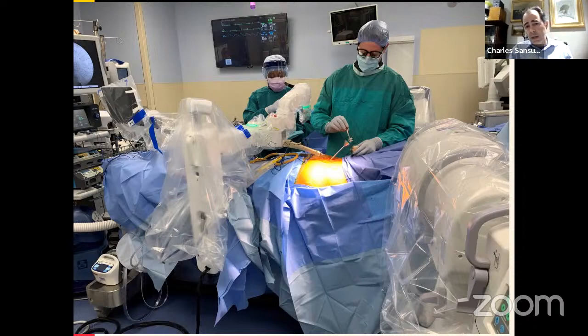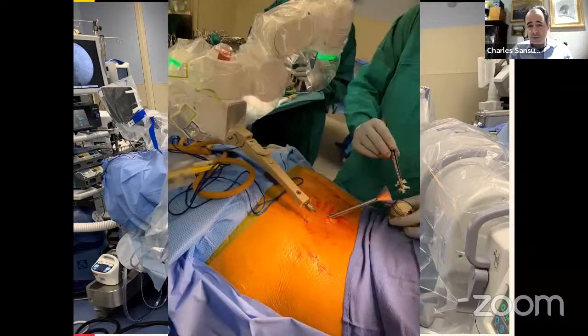The bone funnel is about nine millimeters in diameter. We drill a hole of equivalent diameter to the outside of the funnel and essentially place it all the way down — about 40 millimeters — to the very anterior aspect of the SI joint. Then we pack that funnel full of allograft, and slowly, millimeter by millimeter, pull out the funnel and pack more bone into the joint. This gives you a very good ability to pack the SI joint with bone.